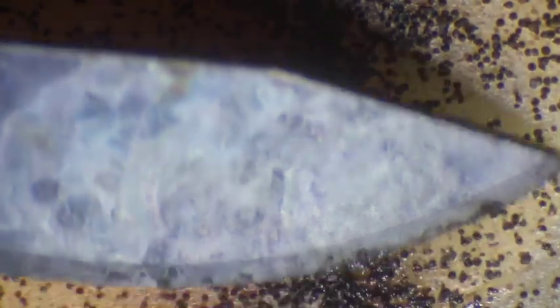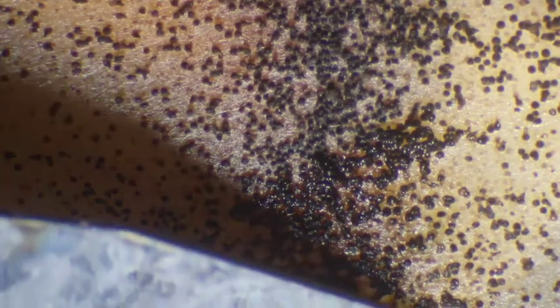So here's the view through the microscope of actually picking these up with the scalpel. So you can see the scalpel there. And so we go down and we just shave off. We grab these little guys.